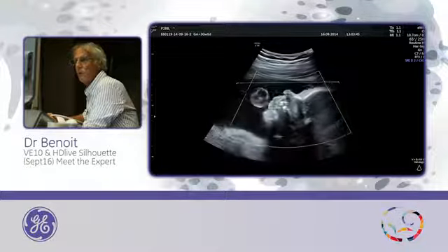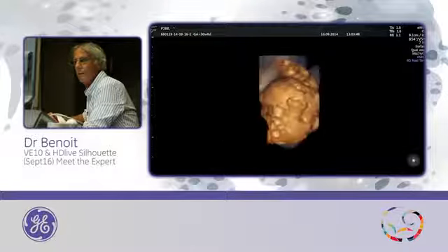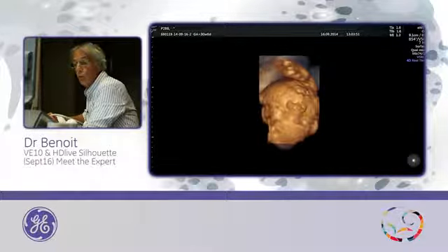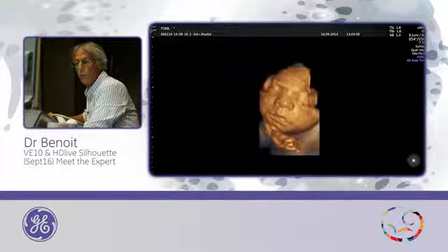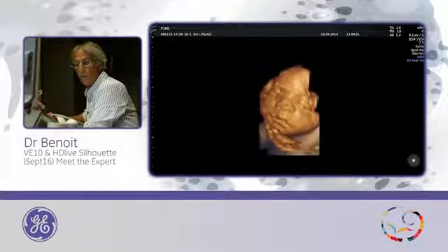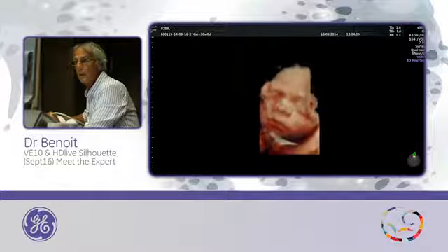I need my foot switch. Yes. Okay. Good. I need to invert, and I need to go to sub-render. No, to go back to main render, to HDlive, and you will take the first one, this one.